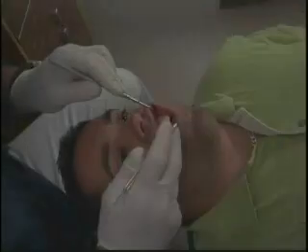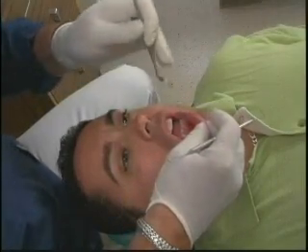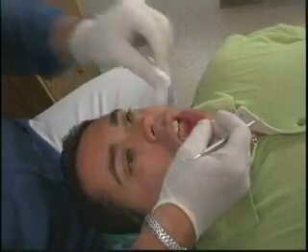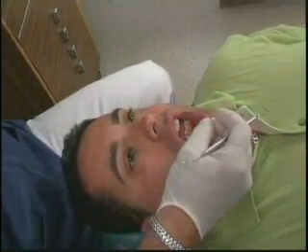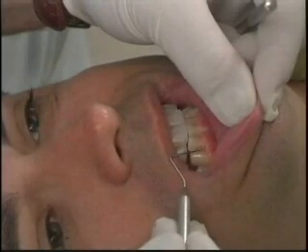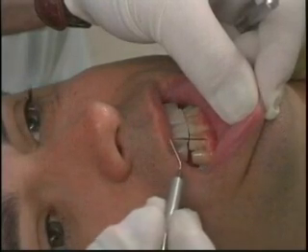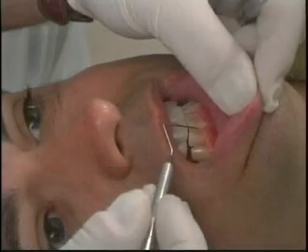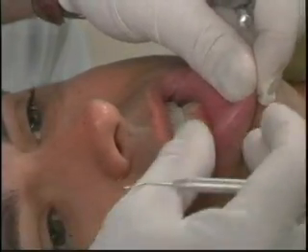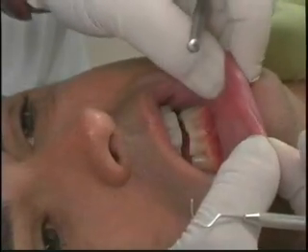After we've done that, we want to look around for some recession. In fact, here is an area down here, right next to the canker sore, where you can see that the gum tissue has receded further down here, and you can see that this tooth is actually longer than this tooth because there's been some recession of the gum tissue down to this level, and again, because of the tartar that's underneath the gum tissue, it bleeds very easily upon probing.